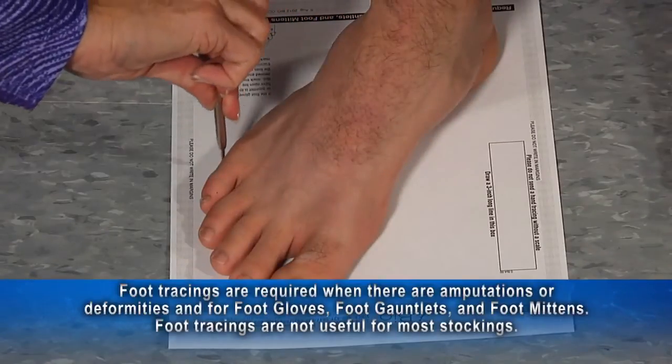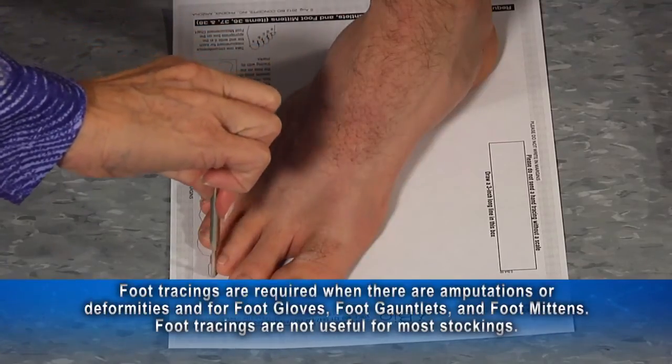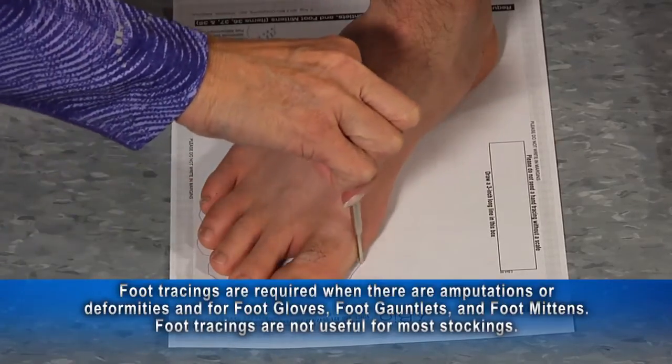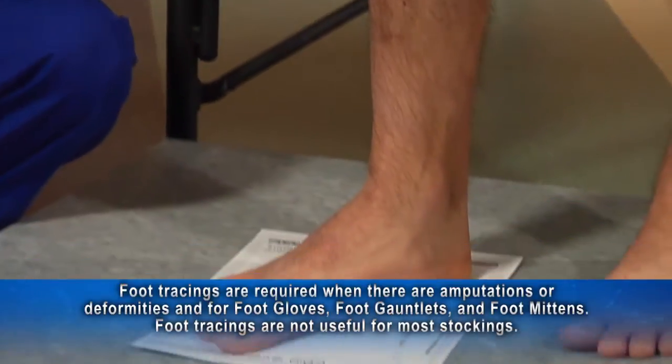Foot tracings are required only when there are amputations or other deformities, and for specialty foot garments like foot gloves, foot gauntlets, and foot mittens. Use the BioConcept's foot tracing guide. For most stockings, foot tracings are not useful.